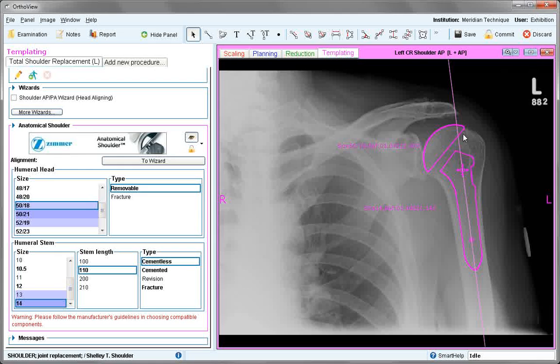In some head aligning systems such as this one, if you right-click you can rotate the head separately from the entire template. Once everything is sized and positioned satisfactorily, save or commit the image to the PACS. This ends the tutorial on the total shoulder replacement.